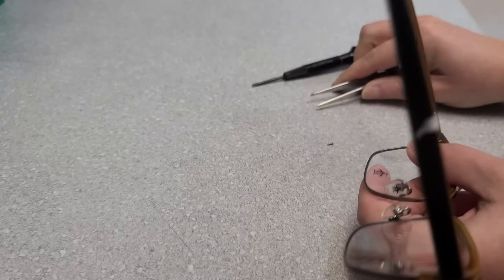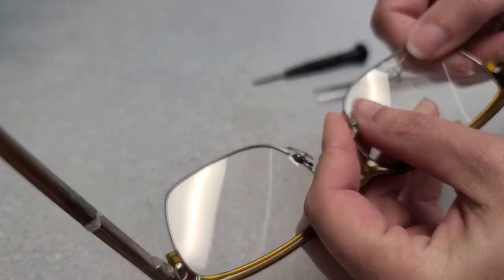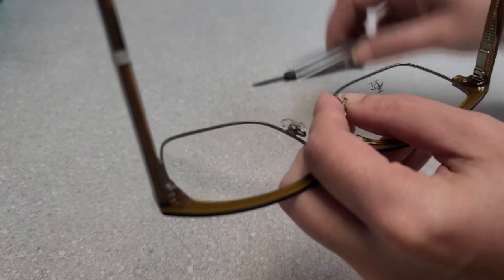Once you remove the screw, go ahead and set it on a flat surface. You remove the nose pad and then change it out with the new nose pad. Make sure you line up the barrel. Then you insert the screw back either with the tweezers or your fingers. Again, protecting the lens at all costs. It's better to scratch yourself than to scratch your lenses.